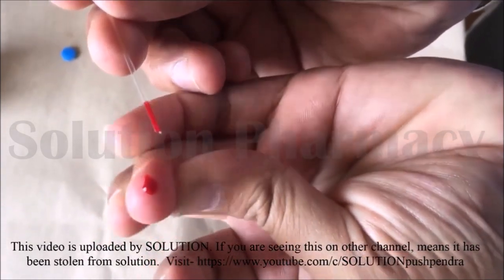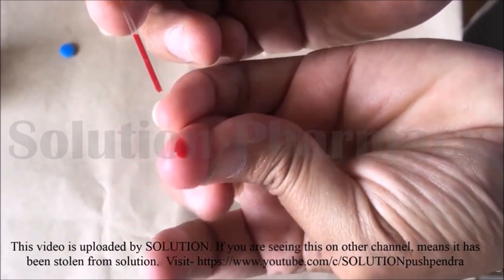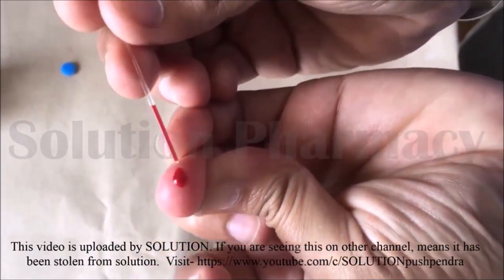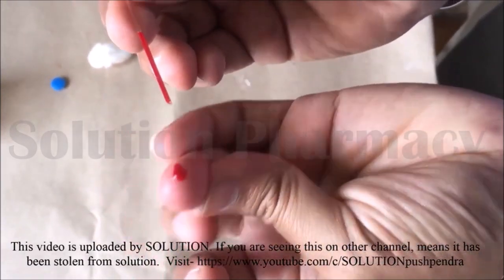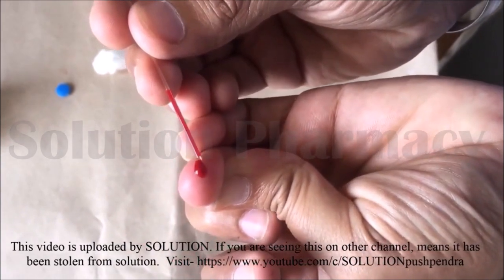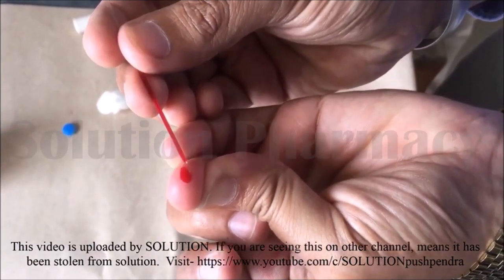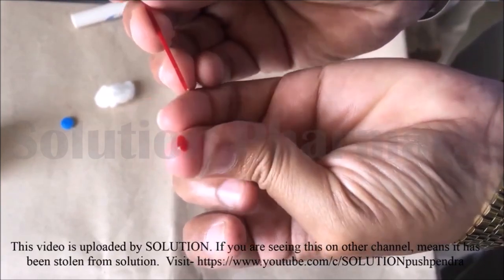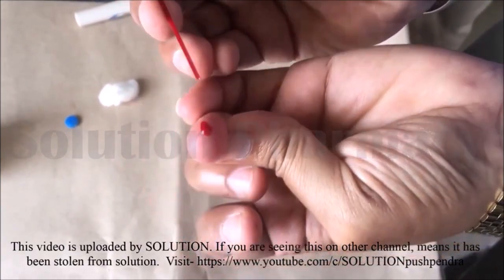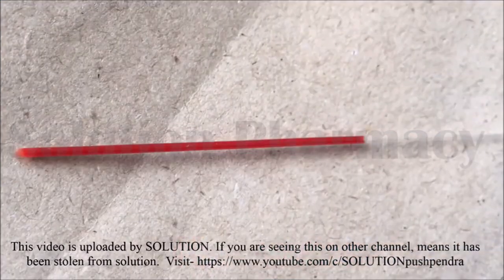You can see here that when we touch the open tip of the capillary tube to the surface of the blood drop, it moves inside the capillary tube through capillary action. And now again you can see a drop of blood ooze out from the fingertip. Again touch one open end of the capillary tube to the surface of the drop of blood. Repeat this process until our capillary tube is filled with blood up to a sufficient length. And now here you can see our capillary tube is filled with the blood. Now you can determine the blood clotting time using this capillary tube.